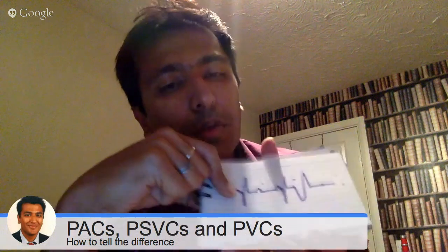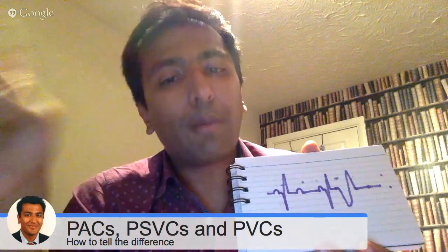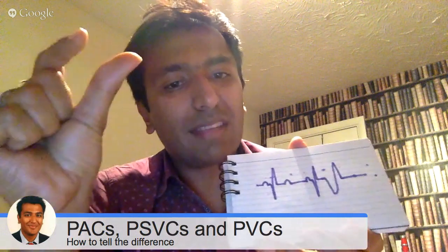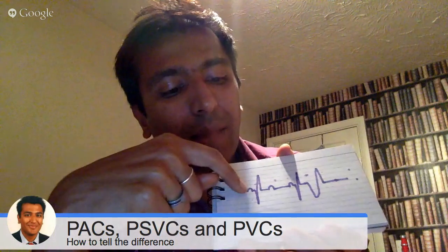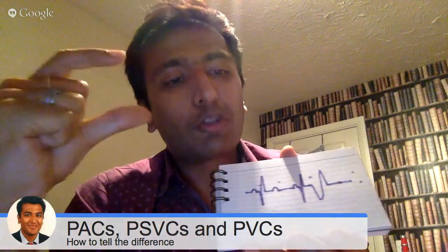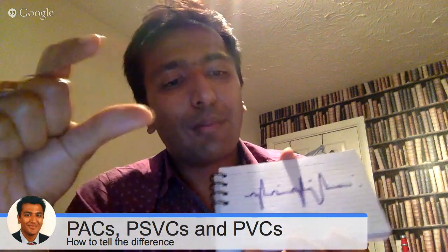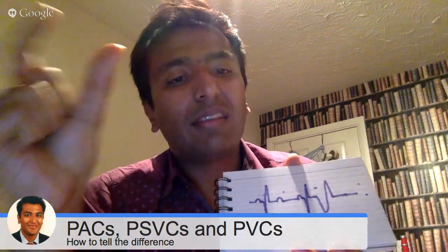There are some people who get something called SVC or supraventricular complexes with aberration. Now, if you have a conduction system disturbance, then you will have broad complexes anyway. And in those people, you can have a supraventricular complex, but because all their complexes are going to be broad, even that supraventricular complex will look broad. And that's why it can be quite difficult sometimes to distinguish between PVCs and PSVCs with aberration.